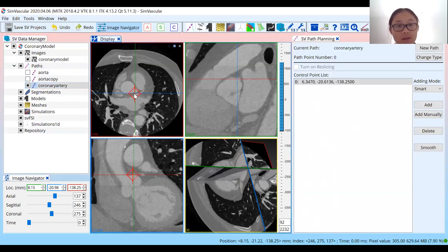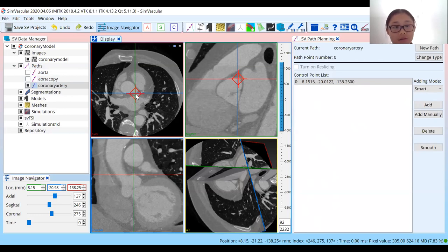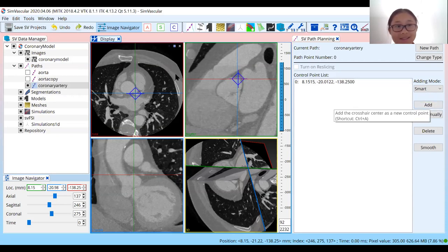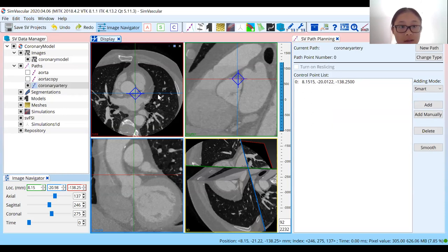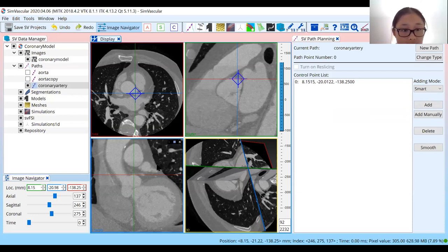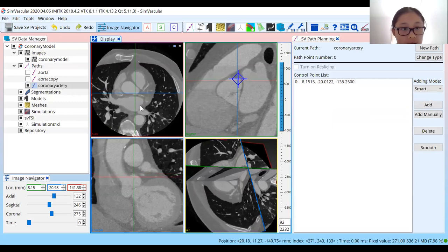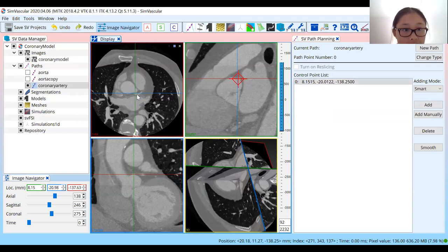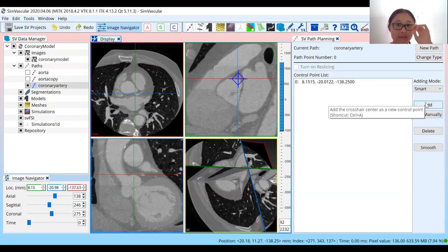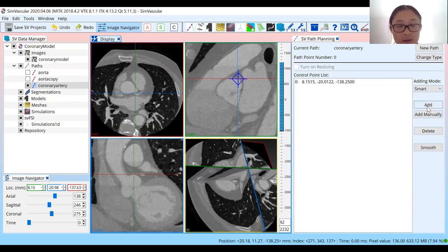Something else you can do with your point is drag it around. If it's a little difficult to add a point manually using control-click, and your crosshairs aren't exactly at the location where you want the point to be added, you can just click Add anyway and then drag the point to where you want it. You can see that we've added a point to that coronary artery, and we can continue scrolling to see where that vessel continues.